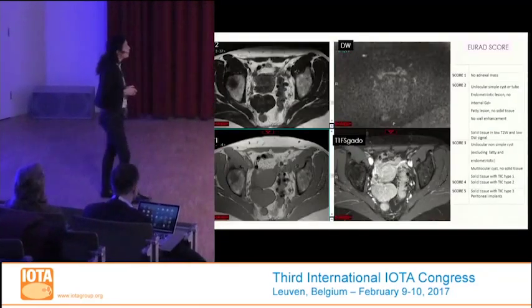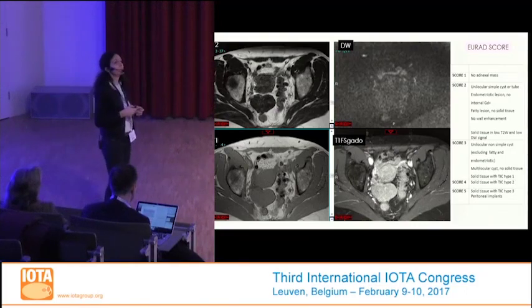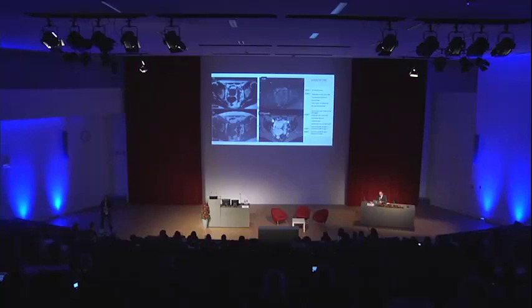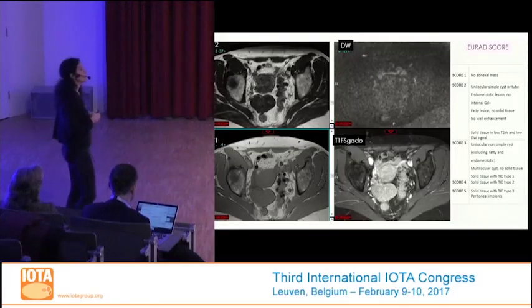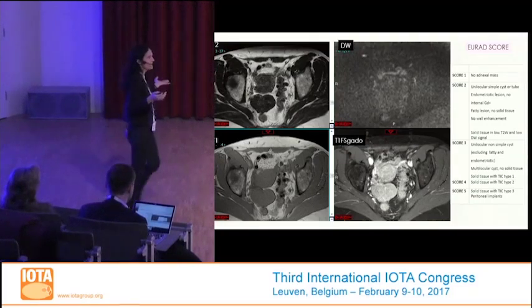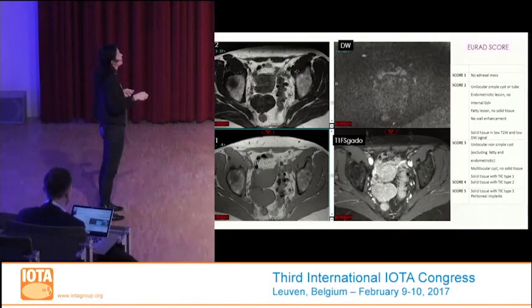And when you look at the MRI, first of all, is there internal enhancement? What do you think? Before, after gadolinium, yes or no? Yes, sure, yes. Okay, is it solid tissue? Yeah, it's only solid tissue. It's a purely solid lesion. You can see it's like that, and everything enhanced after gadolinium injection.